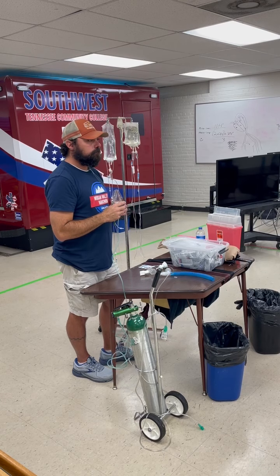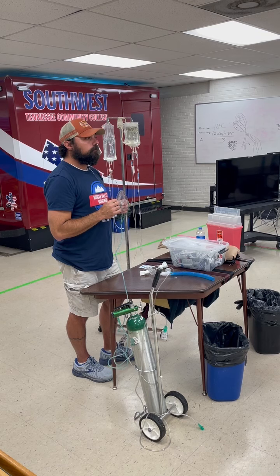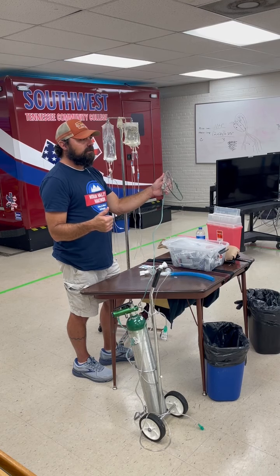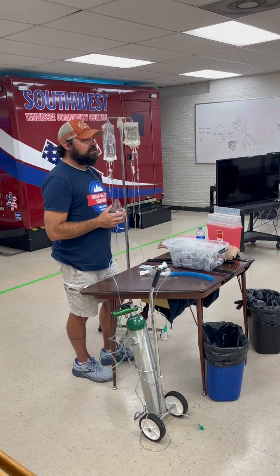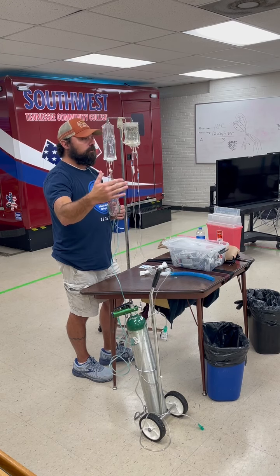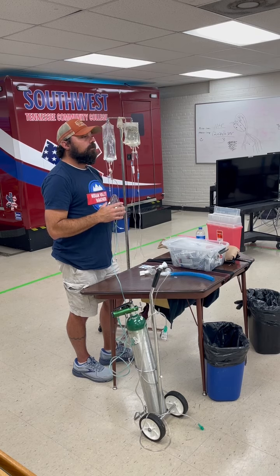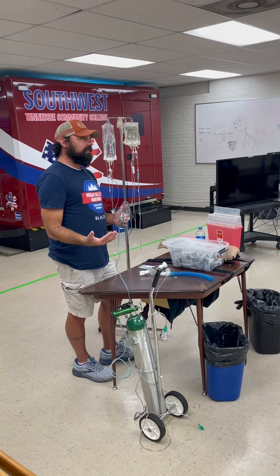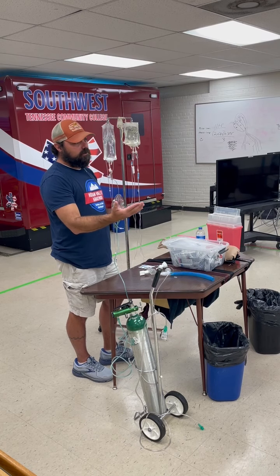I just had a situation question. I worked with a medic one time, we were doing an albuterol treatment, and he kept a lot of nasal cannula on. Is that something we should do classroom-wise? There's nothing wrong with that, unless you have two O2 sources. So what does he have, like a portable and a main? Is that how he was hooked up? I mean, it's not something you're ever going to see in a book. I'm glad you're mentioning that, because I'm going to piggyback on that comment here in just a second. That said, is that wrong? It's not wrong. Is it taught? It's not taught either. And so I will talk about that.